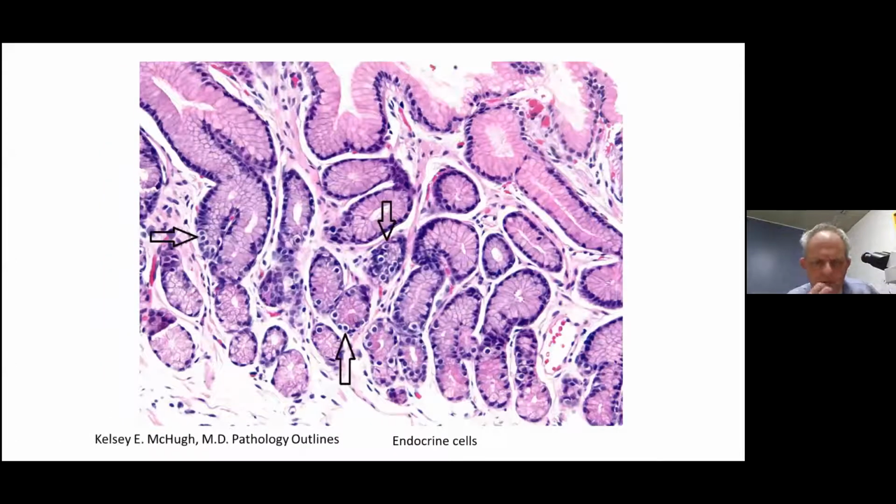And then I just wanted to show you this one, because you will see in many of the histopathology reports, we talk about endocrine cell hyperplasia, particularly in those patients who are receiving proton pump inhibitor therapy. And that's what these cells look like. They look like little lymphocytes, and they are surrounded by cleared cytoplasm, which is actually fixation artifact. So those are typical features then of endocrine cells.